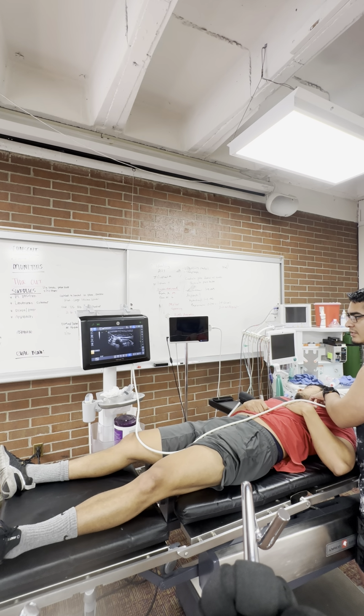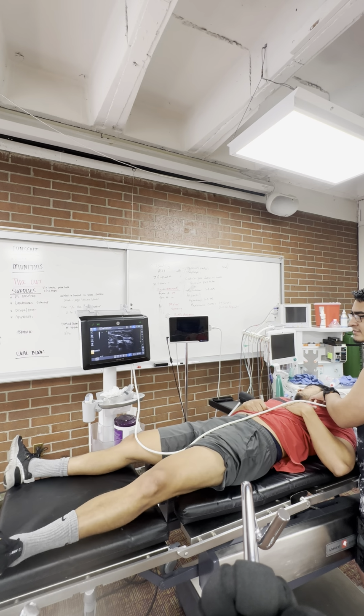So there we see the carotid artery, and then I'm compressing the IJ, and then if I let go of the pressure, I can see the IJ, as well as sternocleidomastoid just appeared to that. So typically we would go out of plane, cephalad to caudad with our needle approach for IJ placement.